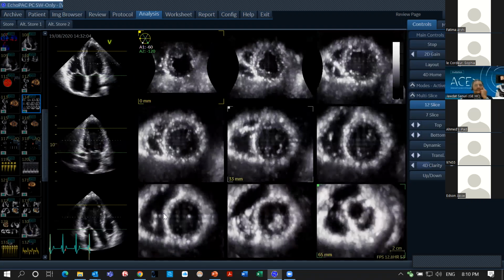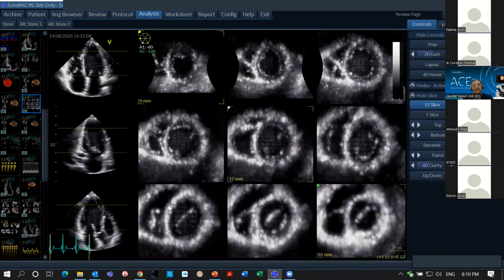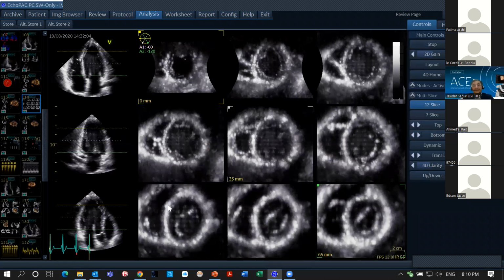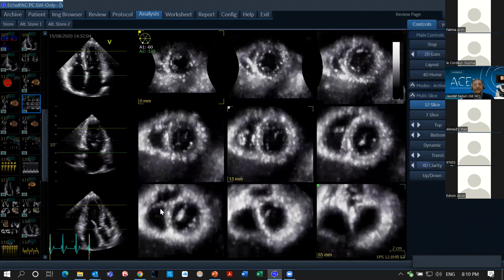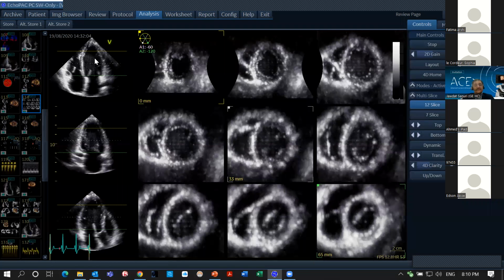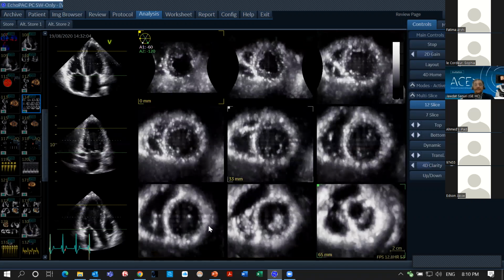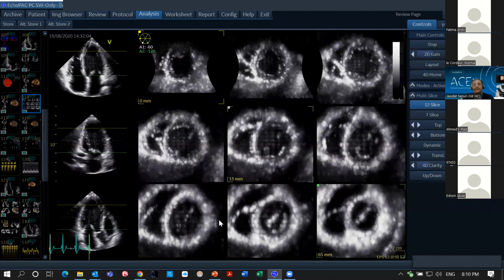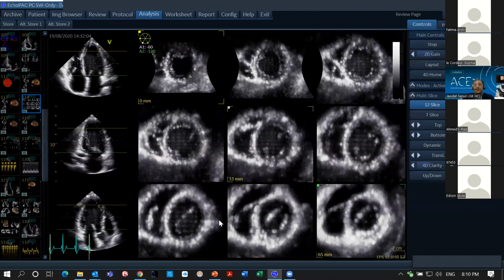With multi-slice here, this is kind of like CT slicing. Whatever you have within the volume is what you have. During live scanning, you can tilt, and the multi-slice will tilt. For example, at this position, if your probe is positioned at 4 chamber, just a simple tilting will show me more of the free wall of the RV, less of the lateral wall of the LV, and that's perfect for RV acquisition.